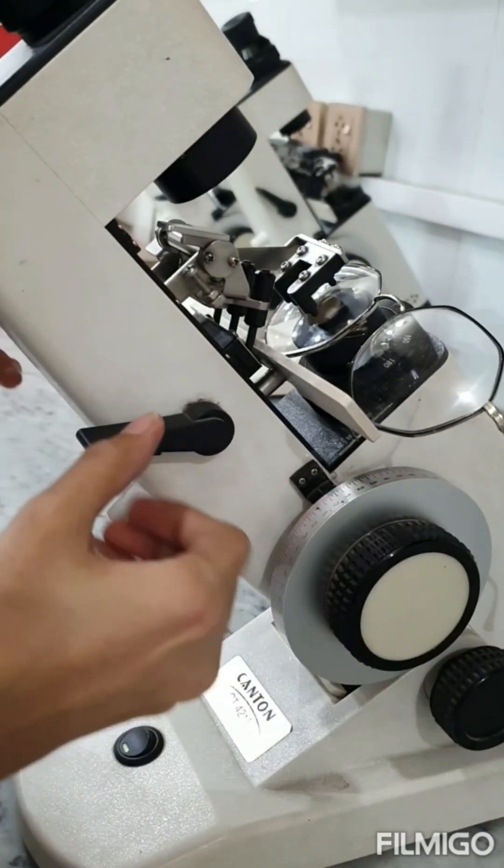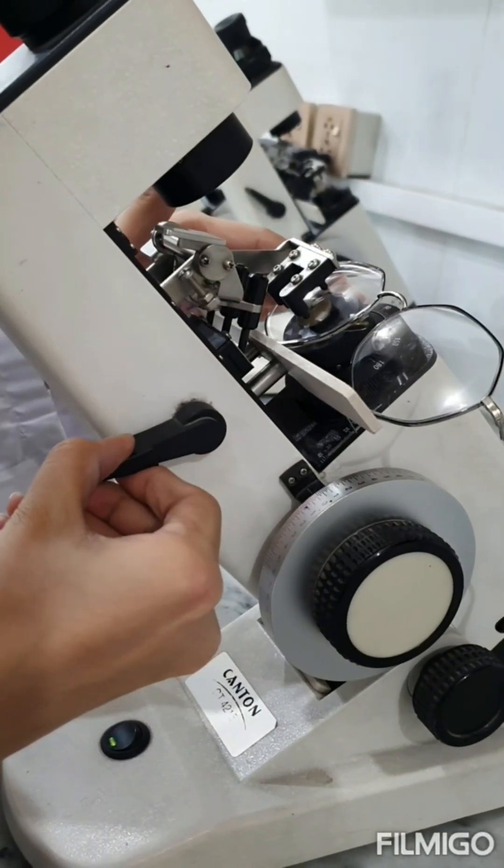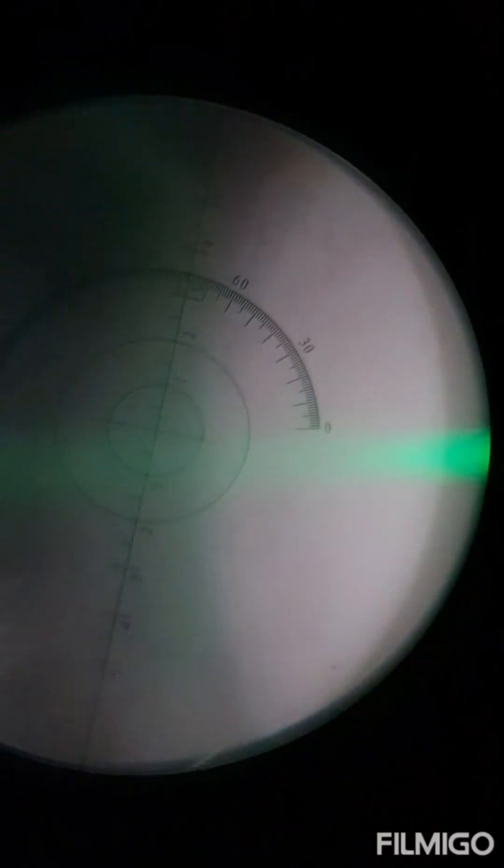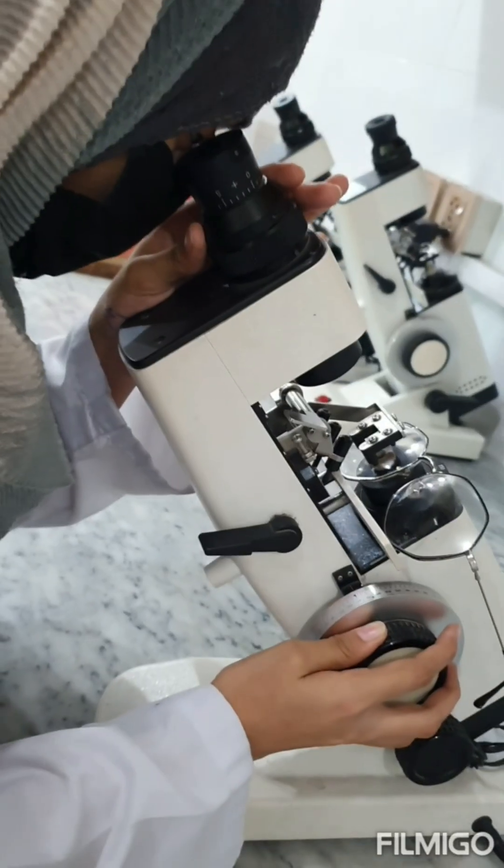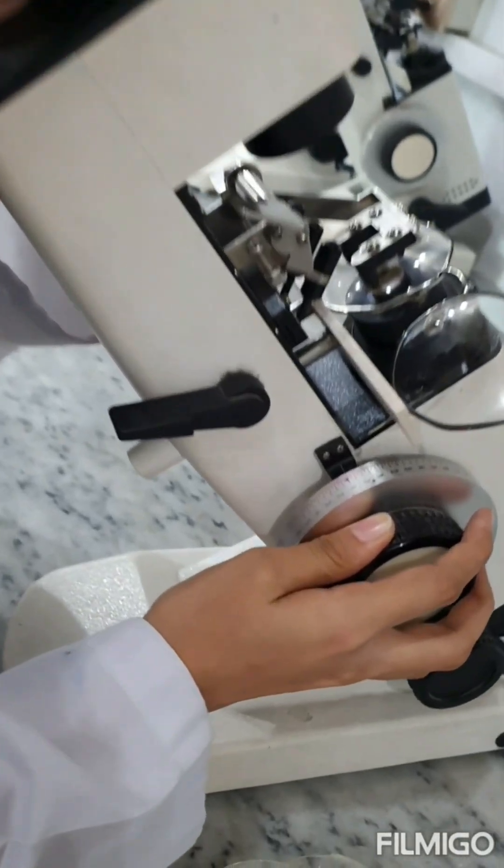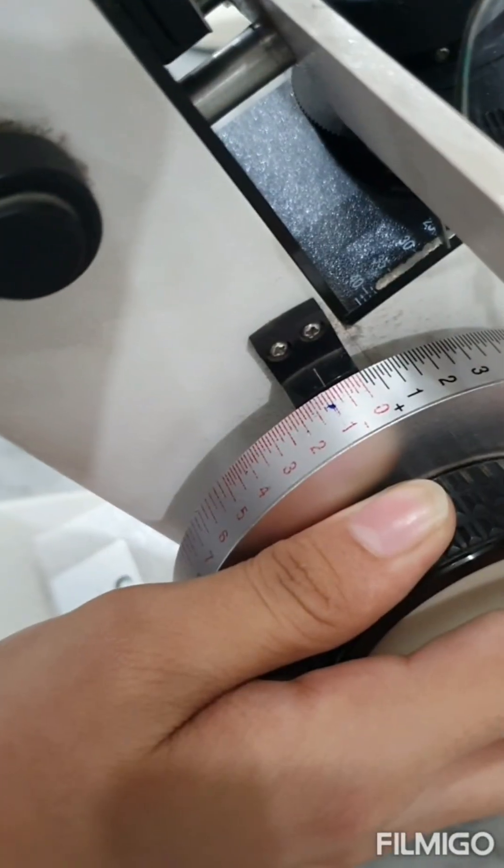After placing a cylindrical lens, we noted that the target is blurred. Rotate the power drum such that any one meridian along with the central dotted mires becomes bright and slightly clear as compared to other meridians.